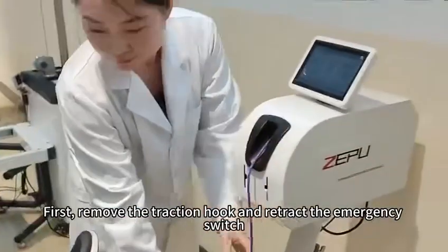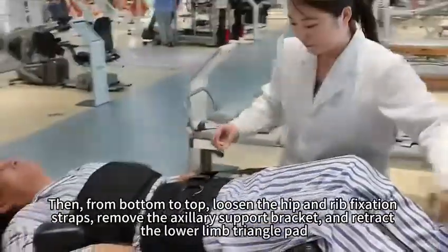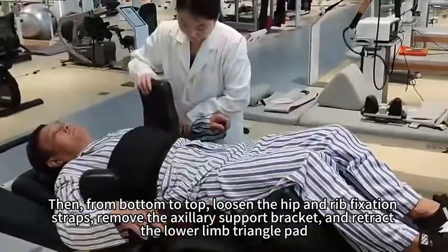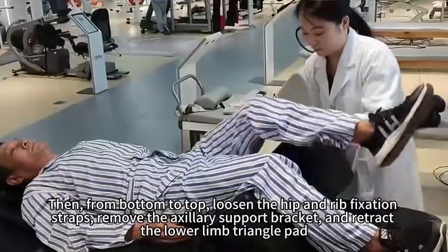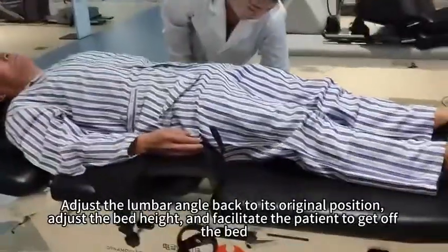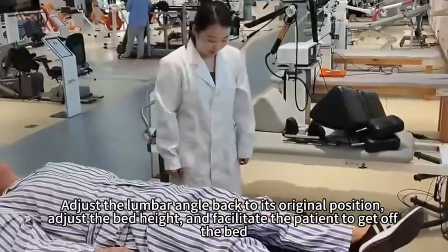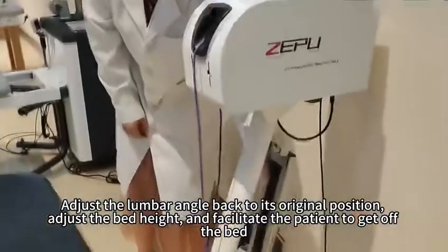First, remove the traction hook and retract the emergency switch. Then, from bottom to top, loosen the hip and rib fixation straps, remove the axillary support bracket, and retract the lower limb triangle pad. Adjust the lumbar angle back to its original position. Adjust the bed height, and facilitate the patient to get off the bed.